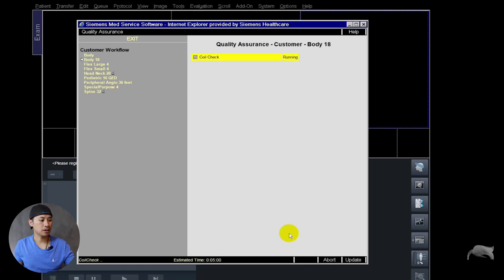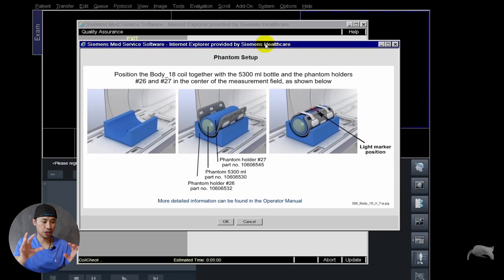Then you will have guidance showing you how you should position the phantom — everything exactly the same. After you've done that inside the scanner, you go out and push OK, and then it will continuously do the testing for you. After a few minutes it may ask you to go in, unplug the contact, change the position, then continue. For the body 18 you have to unplug and plug it a few times before it's finished. Just follow the instructions — it's very easy. If you do one step wrong, you might have to do it again, so be very careful positioning everything.